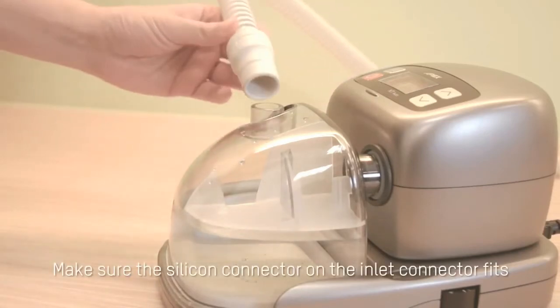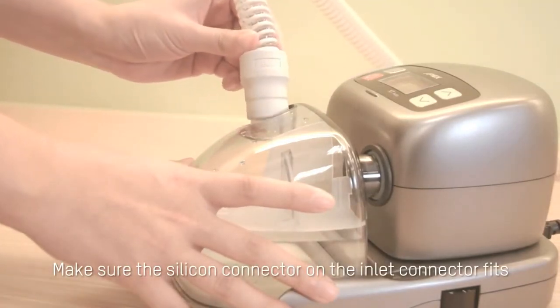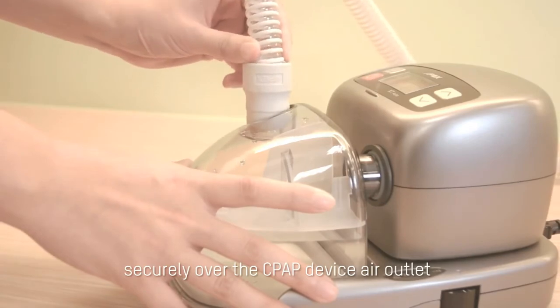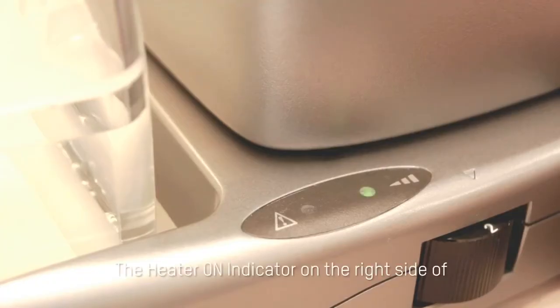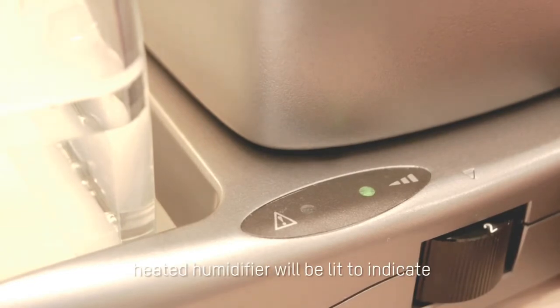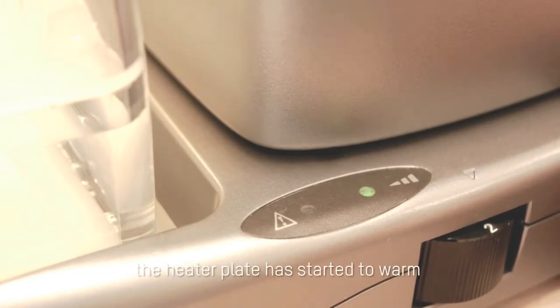Make sure the silicone connector on the inlet connector fits securely over the CPAP device air outlet. The heater on indicator on the right side of heated humidifier will be lit to indicate the heater plate has started to warm.